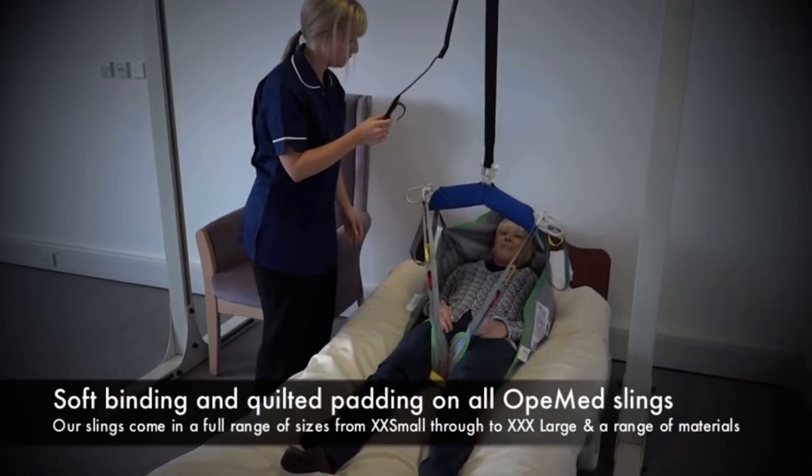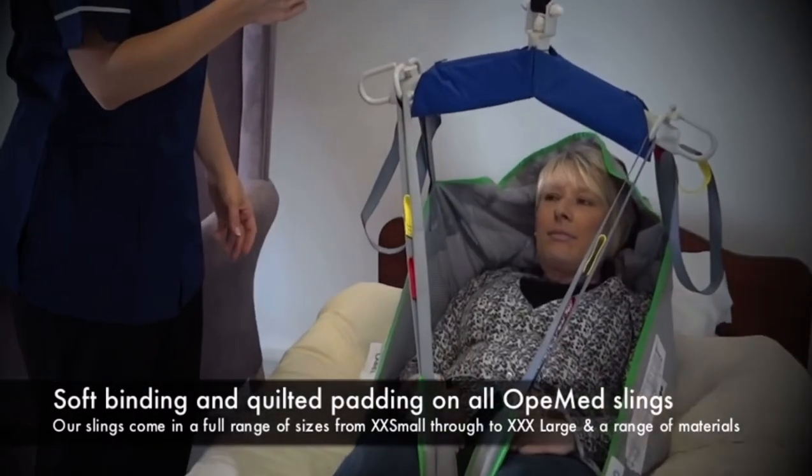The client is then hoisted up from the bed and will be transferred into a postural seating chair.